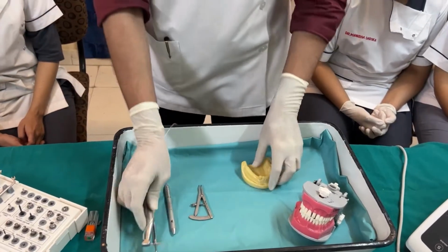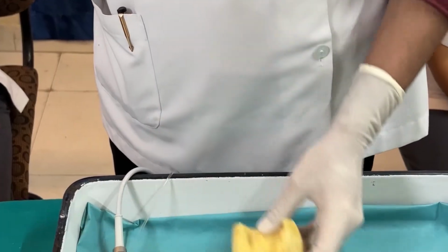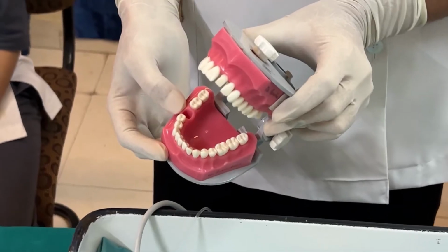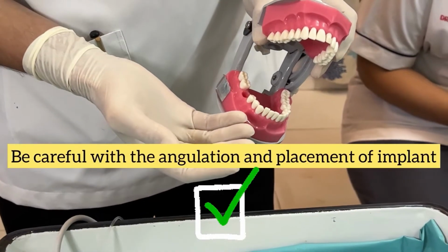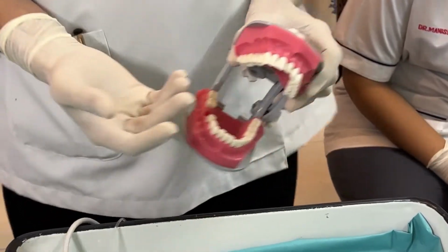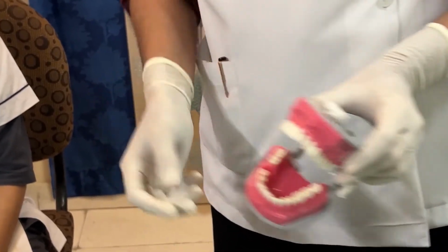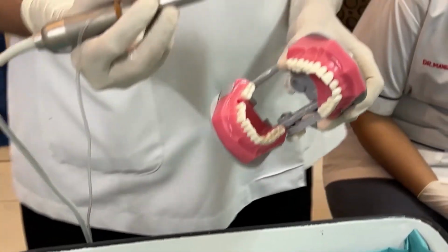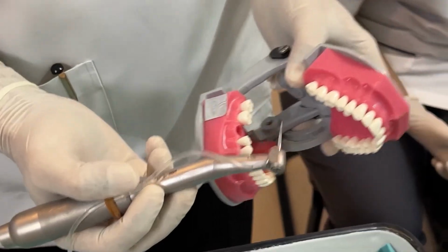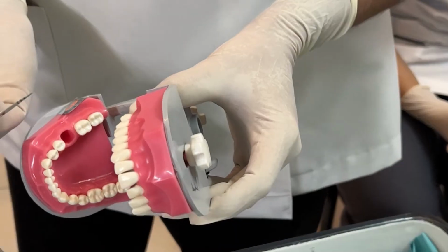Okay, so suppose I want to start osteotomy preparation in this area, or for that matter in any patient in which a missing tooth is there. There are few things that I need to keep in mind with regard to angulation and placement of the implant. With regard to placement, I already covered the 1, 2, 3 rule that will tell you where to place. With regard to angulation, the rule is simple: be it a natural tooth or be it an implant, forces are best borne if they are directed along the long axis of the implant or the tooth.